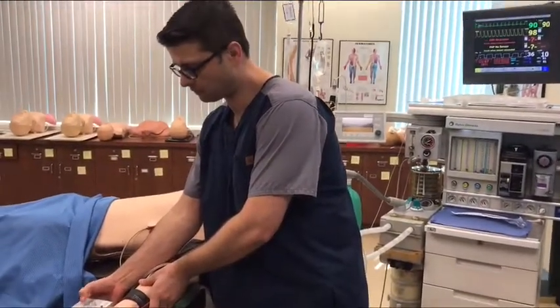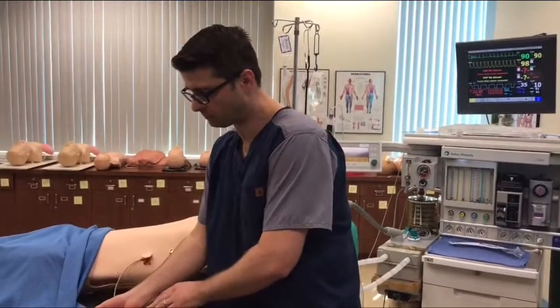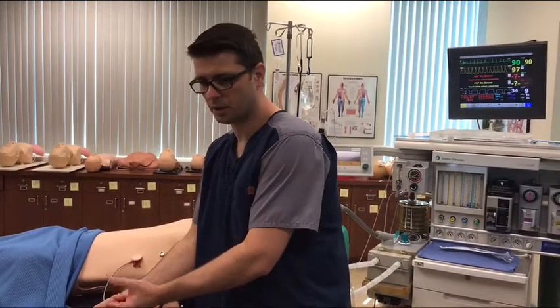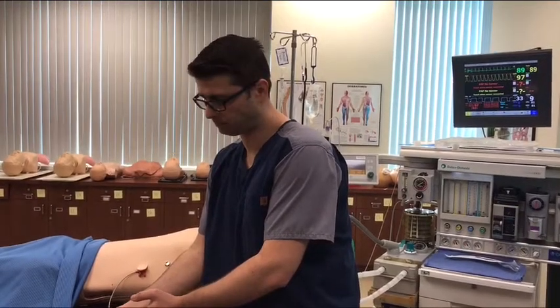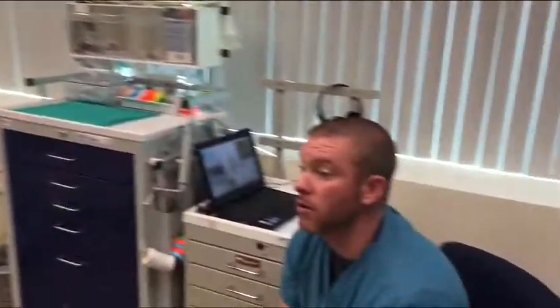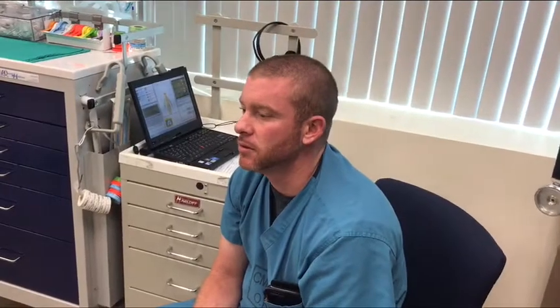Okay. And what would your response be that you are looking at right now? I should see some twitching. You mean the thumb? Okay. So I should see some twitching. So what are you doing right now? You have 1 out of 4 twitches. I'm gonna wait maybe another minute or two.